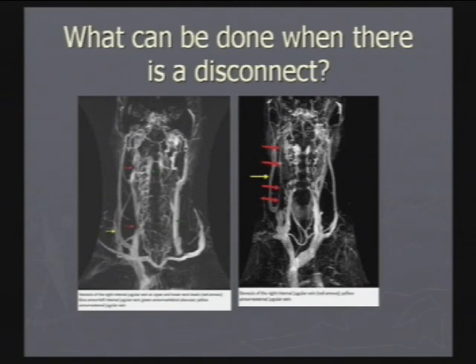I think this example here shows a little bit better the case that I was talking about, where you get this stump appearing in the upper right jugular, and then you have other veins that are draining into what was the conventional jugular vein. But nevertheless, there are still two more stenosis in that internal jugular. So if you were to go up there with a catheter, you'd find your way to the top, but you would not be finding your way into the sigmoid sinus. So here you can actually tell from this the type of problems that are taking place.